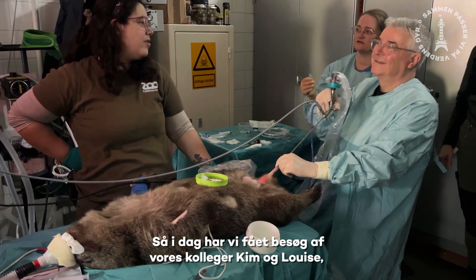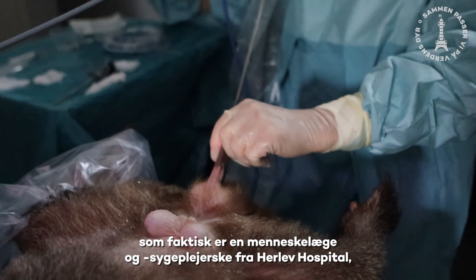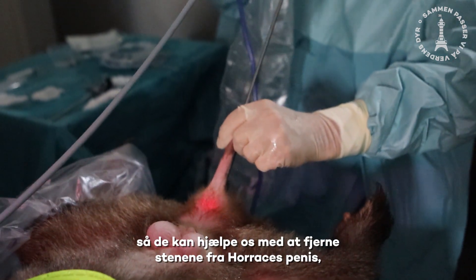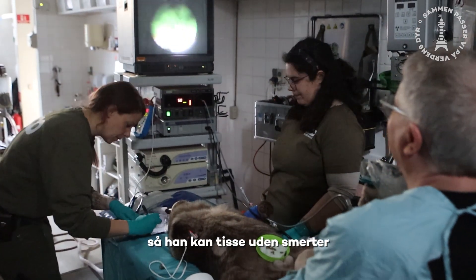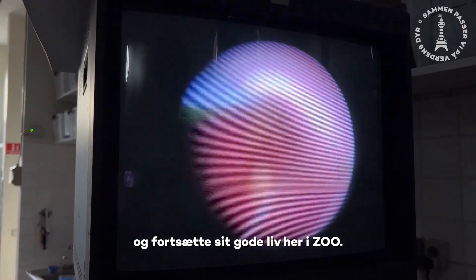So what we've done today is we've brought our colleagues here, Kim and Luisa, who are actually a human doctor and a human nurse from Herlev Hospital, with their specialized equipment and experience. You can see that they're helping us remove the stones from Horace's penis so he can urinate much nicer. He's not in pain anymore and can continue living a nice life here at the zoo.